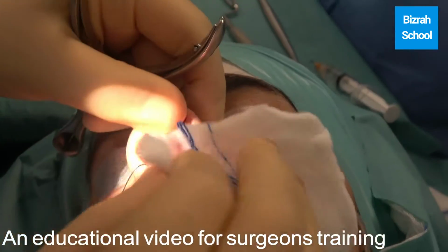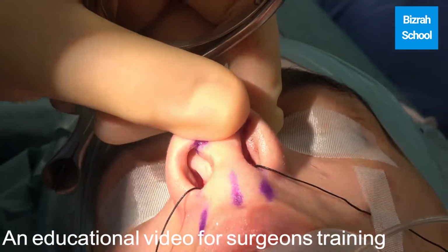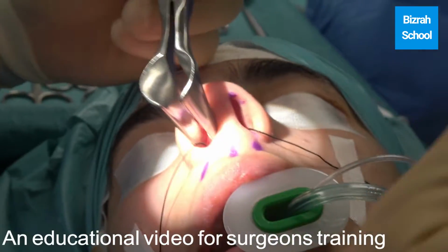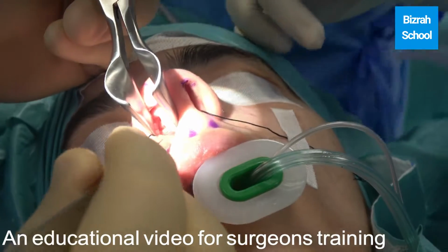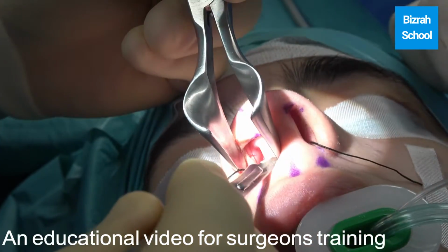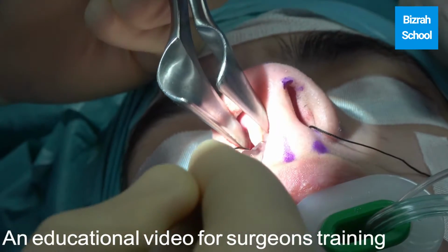We'll start with the septoplasty, as the patient has right caudal dislocation. It's quite obvious. So we start our incision along the caudal septum, just 1 or 2 millimeters behind, and we need to look for the right plane.